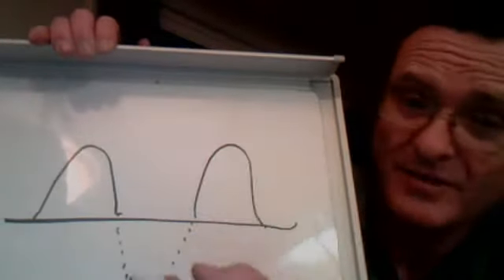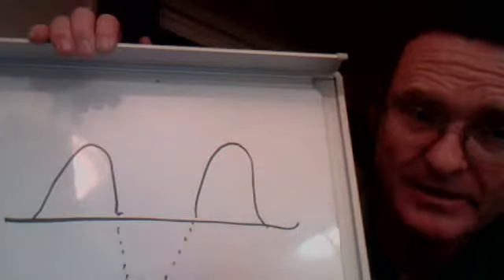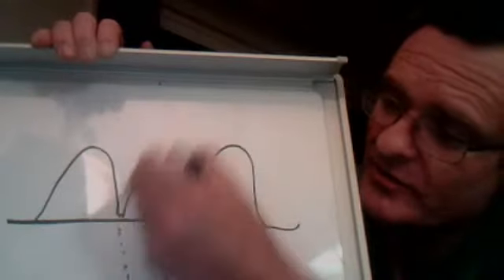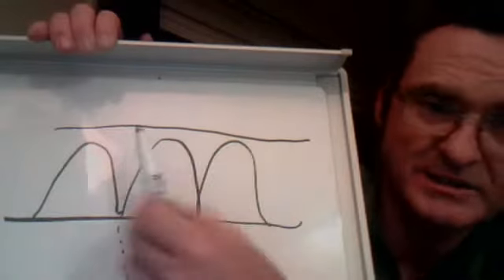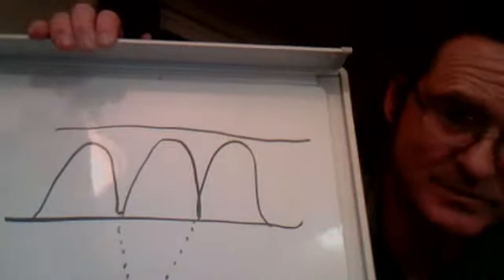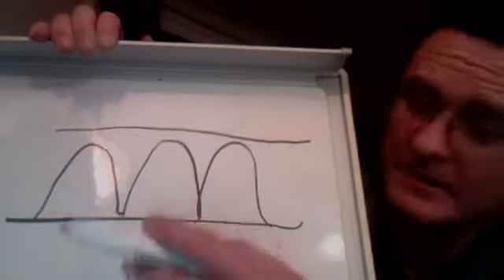Now, some of the modern machines, the circuitry can actually take this negative swing in the electrical generation wave and turn it into another positive, which makes for almost a steady generation of X-rays coming out, and thus allows you to halve the exposure time, even though the patient is getting the same amount of radiation.